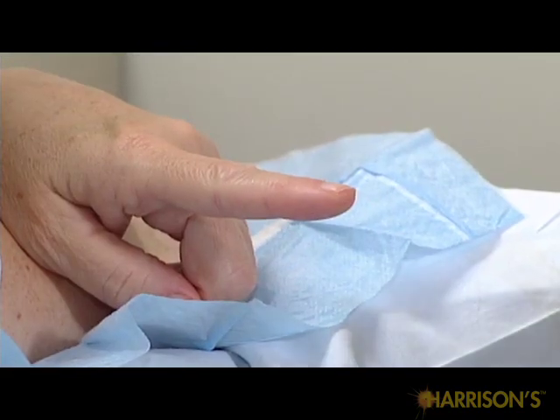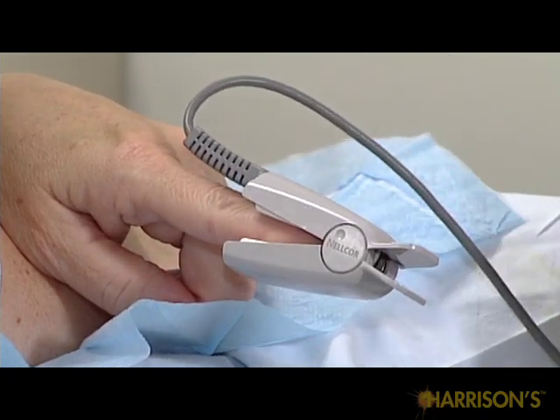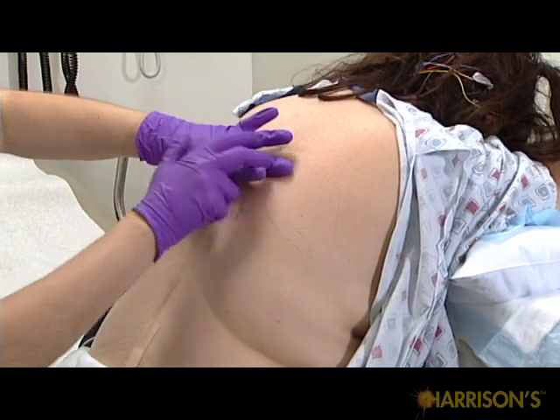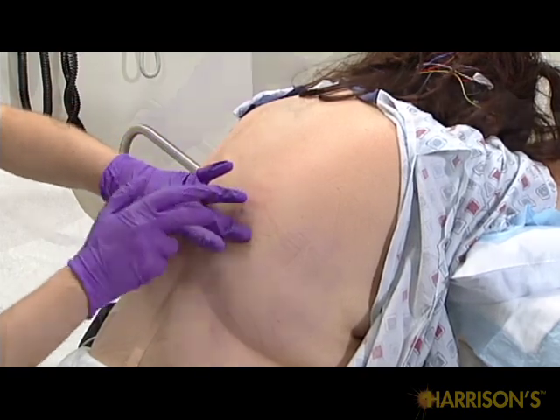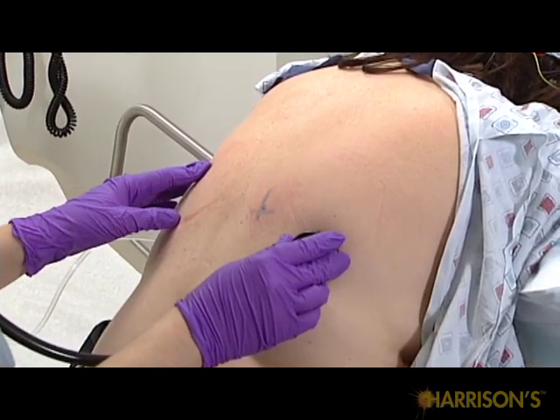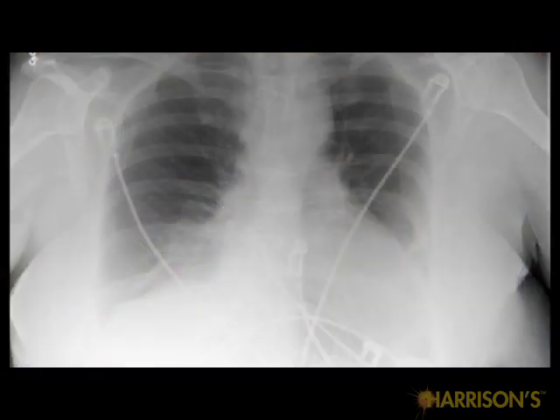Place the pulse oximeter on the patient's finger to provide continuous heart rate and saturation monitoring. Re-examine the patient's posterior chest by both percussion to identify dullness and auscultation to identify absent breath sounds. This indicates the level of the pleural effusion. Confirm the site that you plan to drain with the patient and the chest x-ray.